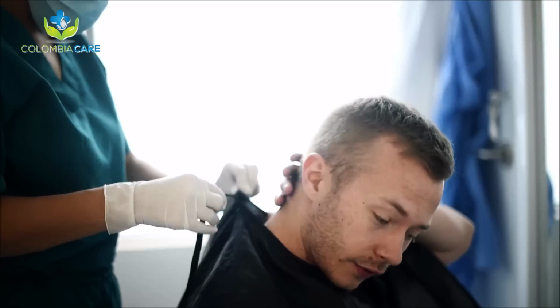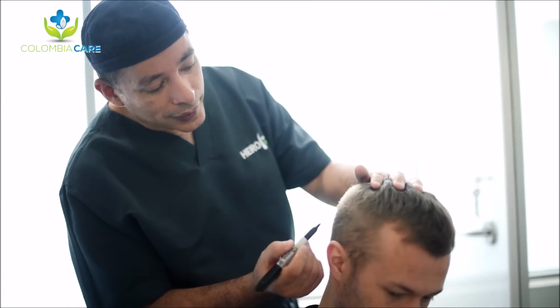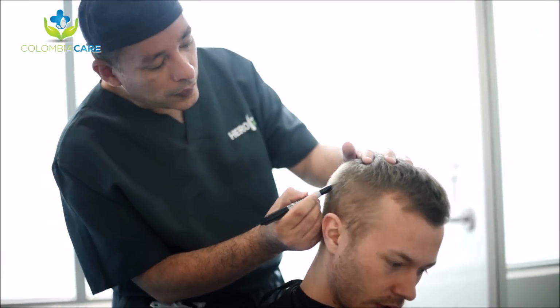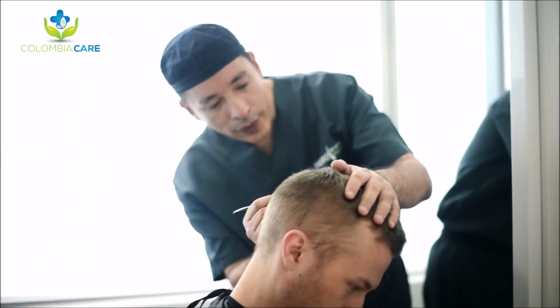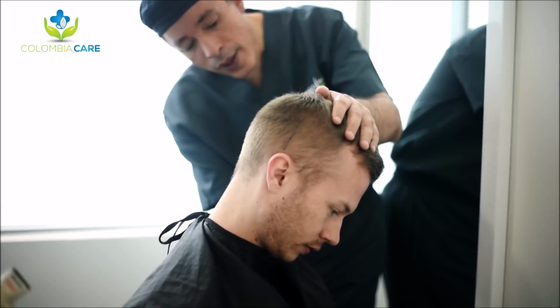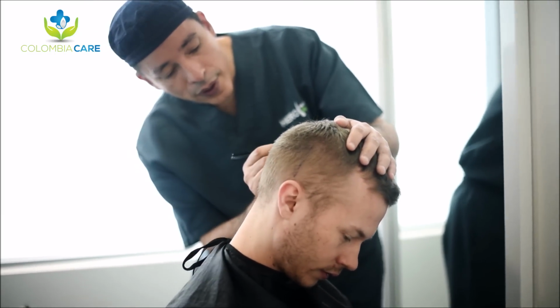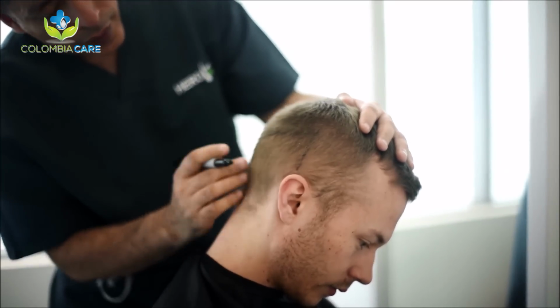So right now I'm going to get my hair cut. Basically we're going to shave the back of the head, where the donor area is situated. Okay, Nicolas, now I'm going to do the design in the donor area. The donor area is where you're going to extract the grafts with the ARTAS, right? Yeah. Here is the area we are going to shave. That part is going to be shaved so that the robot can access the grafts.